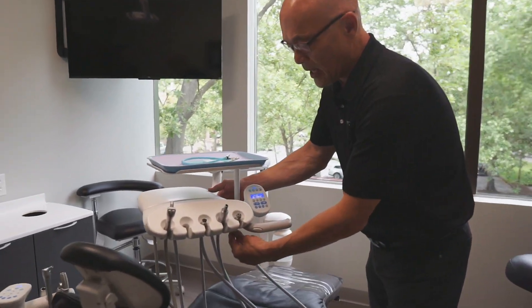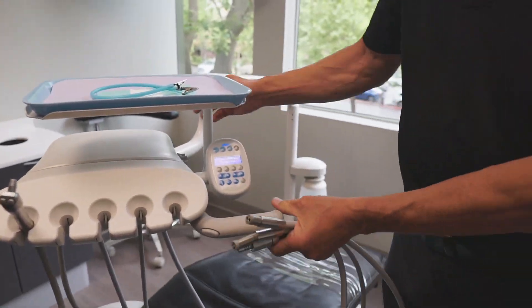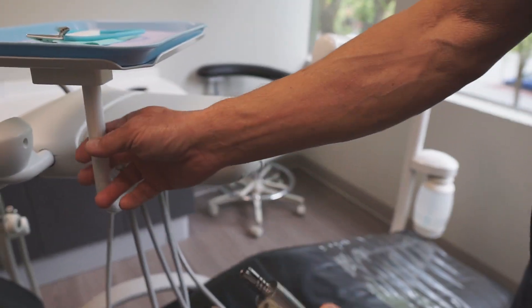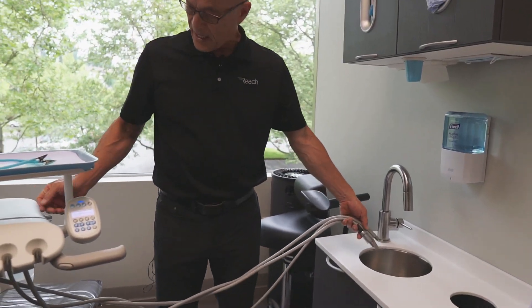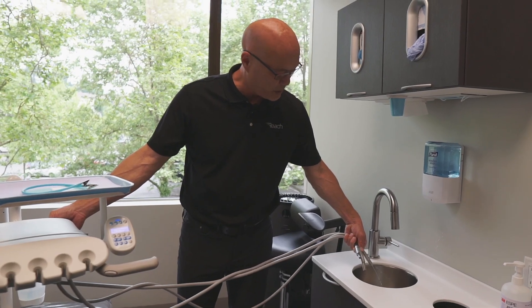On this particular unit, there is a flush toggle on the back. What you do is take your handpieces over to the sink and just hold down that lever, and water sprays out.